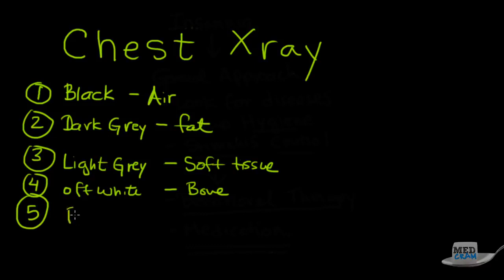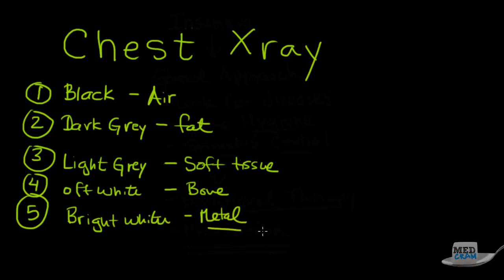And then finally, you're going to see bright white. These are things like metal, which is sometimes seen on chest x-rays, either because of pacemakers, defibrillators, or even buckshot from gunshot wounds. So these are your five things that you're generally going to see.